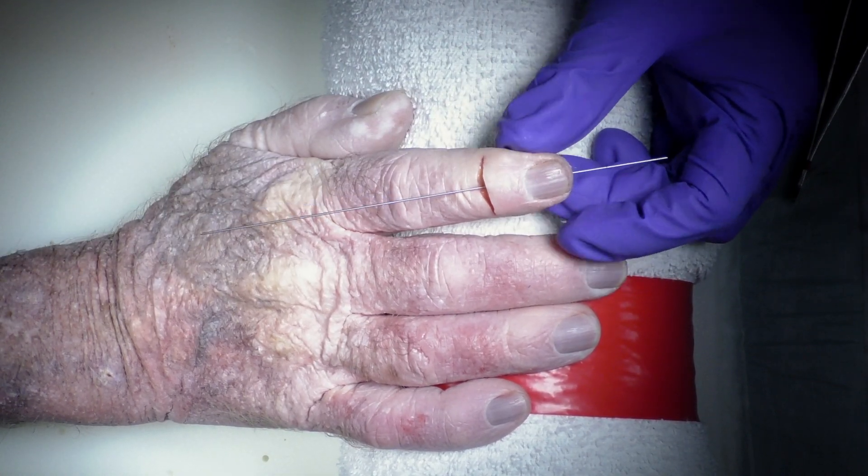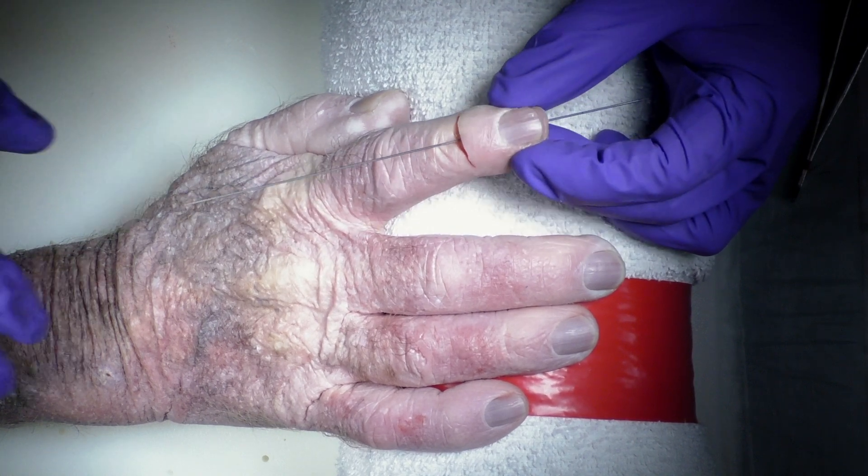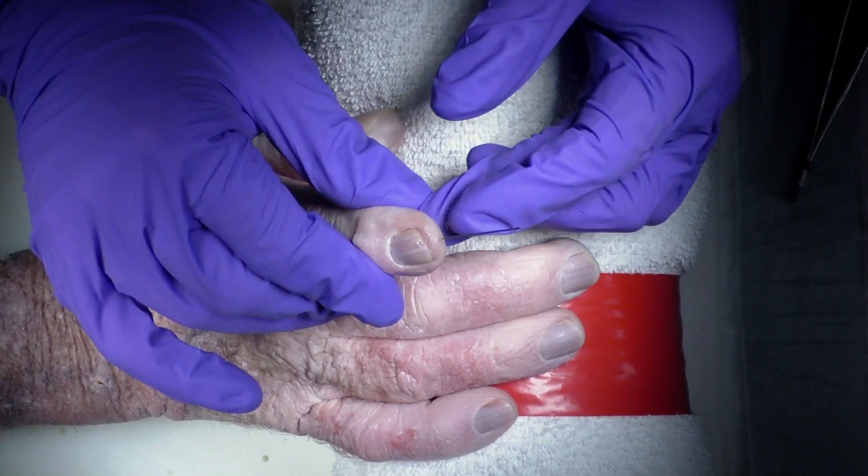You'll see the pin coming out the distal phalanx just beneath the nail plate, and then you can check your alignment under fluoroscopy to make sure that you like the alignment.